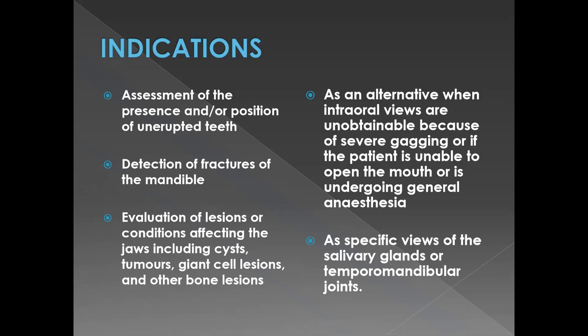In old times, these were obviously taken as specific views for the salivary glands or for the evaluation of the temporomandibular joints.